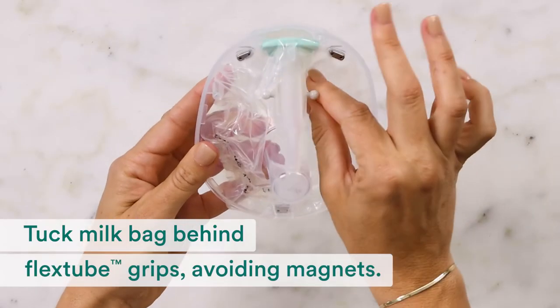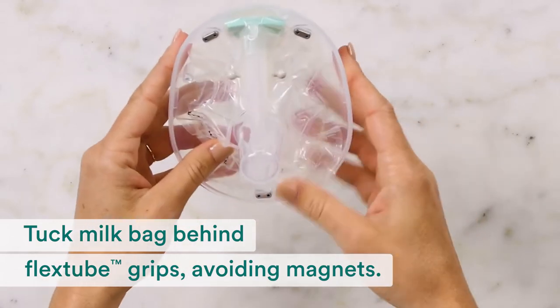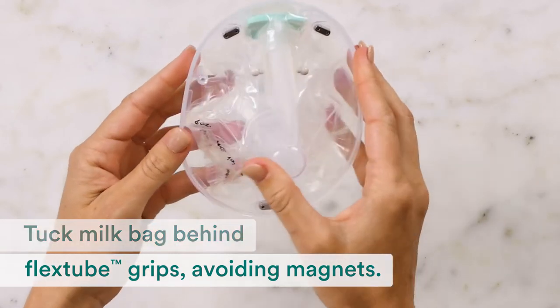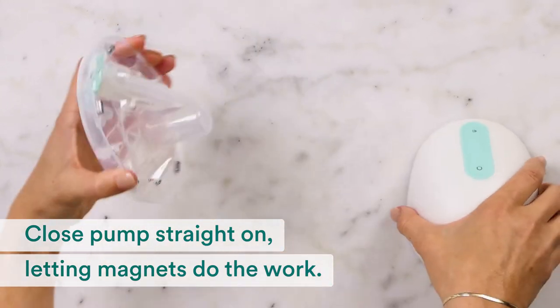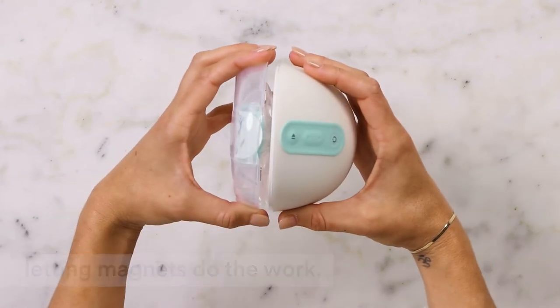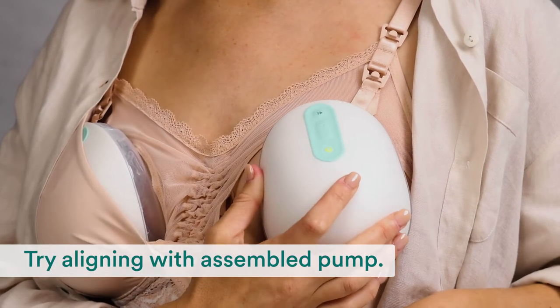Next, tuck the milk bag behind the flex tube grips. Make sure it doesn't interfere with the magnets. Let the magnets do the work as you carefully close the pump again — close it straight on, not from the bottom or the side. Make sure the flex tube grips go into the pump sockets. Try aligning again with your assembled pump.